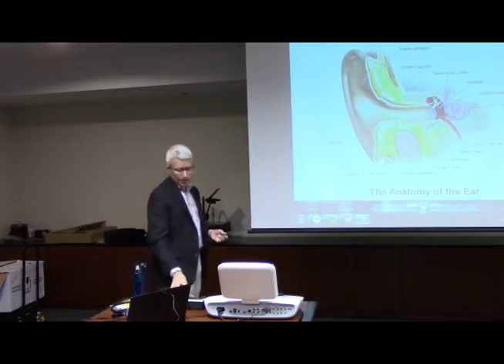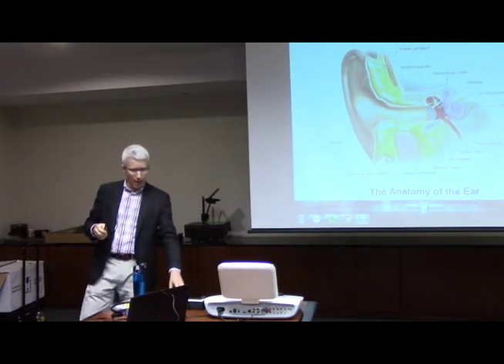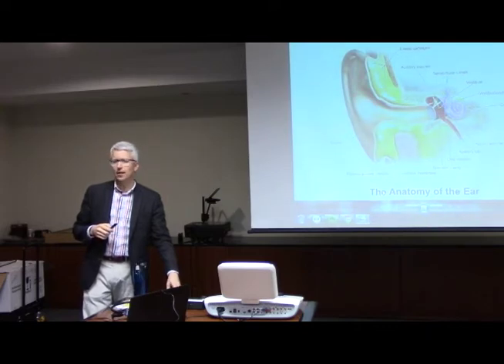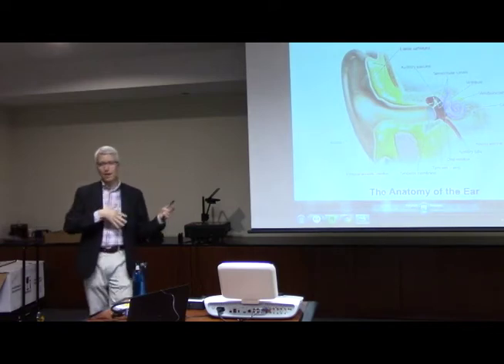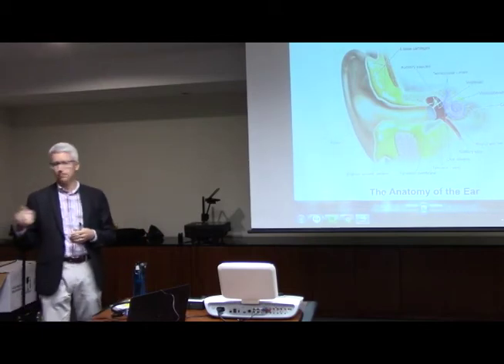So this one here I said does just pure tone air, and that's all it does. There are some that you can get that will do air and bone, although that was the MA40. You can't get the MA40. I think the MA25 is coming out there with bone. Is it? Okay. Either way. Yeah, so Maico had the MA40, they've recently stopped selling it. So I think they replaced it with the 25 that's going to have bone. Okay, good. That's good to know.